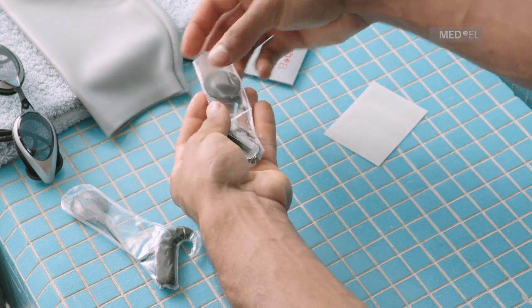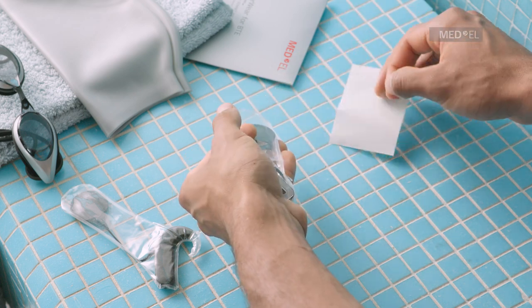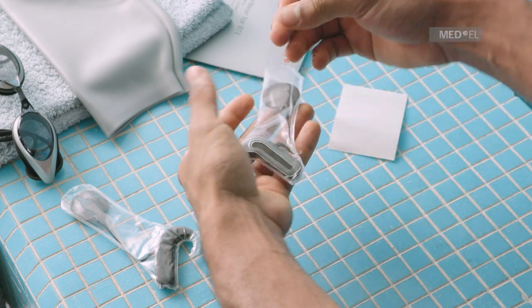With clean, dry hands, apply the adhesive strip to the bottom of the battery pack, following the shape of the processor, but do not seal it completely.